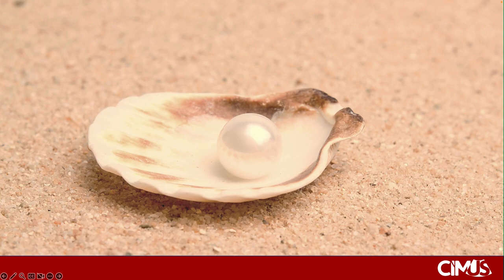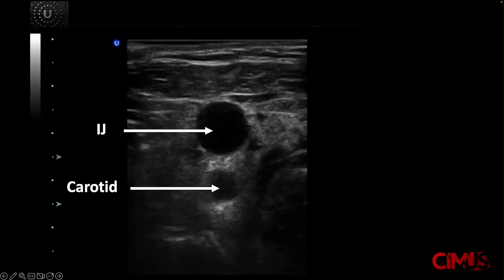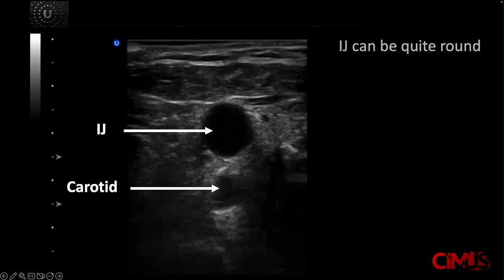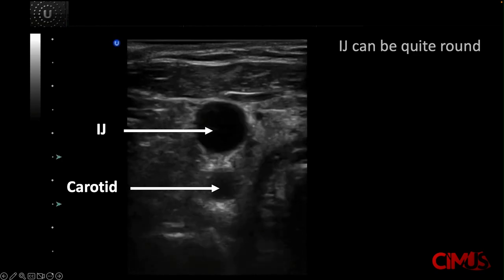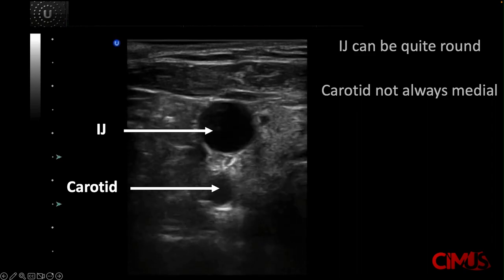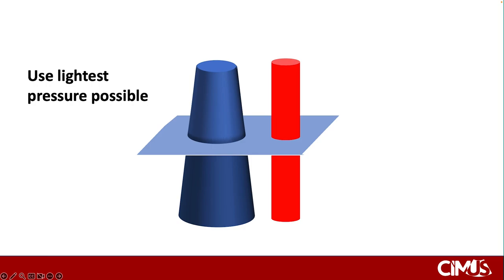Now that you know how to examine the JVP using ultrasound, let's go over some pearls. First, be aware that the IJ can be full and round, so don't mistake it for the carotid. In addition, anatomy can be quite variable — here, the carotid is underneath the internal jugular vein and not medial to it. Use as many methods as possible to confirm that you're looking at the internal jugular vein before you start measuring it. The IJ is compressible and the carotid is less so, meaning at any given cross-sectional level you can compress to make the IJ smaller than the carotid — so don't compress. Actively lighten the pressure on the IJ to a point of just losing contact with the skin.